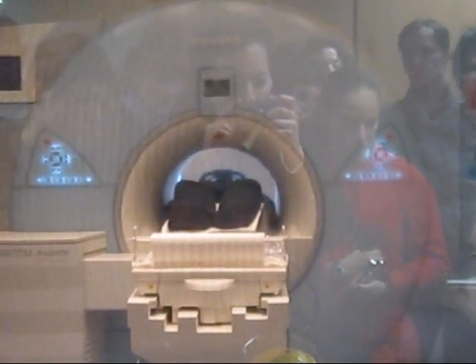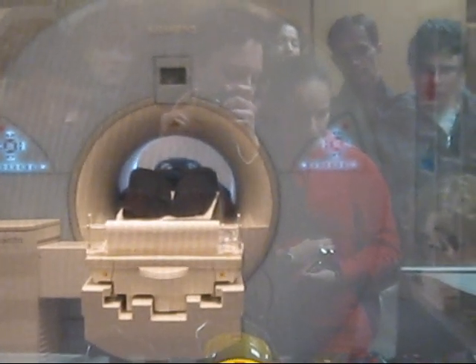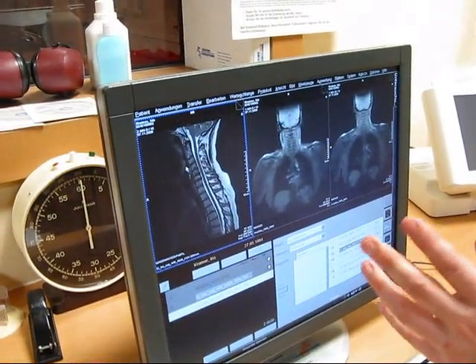The next sequence will take about 4 minutes. Every sequence has a different sound — this is the sound of this sequence. This is the final scan, or one sequence of it.